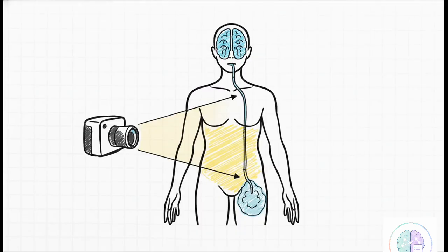Immediately after that injection, you bring in the gamma camera to track the isotope, and you're targeting 3 very specific areas. First, the abdomen. You image this instantly just to confirm you didn't accidentally inject straight into the distal tubing. Next, the cranium. You want to see the isotope diffusing upwards into the ventricles, because that verifies your proximal catheter is actually patent. And third, you image the distal catheter tip down in the abdomen to rule out any localized pooling that would signal a pseudocyst is forming.